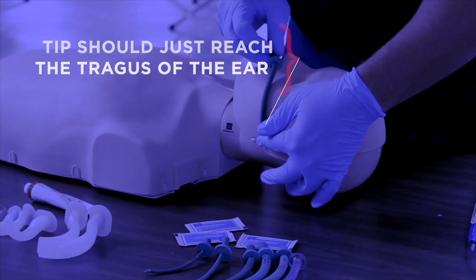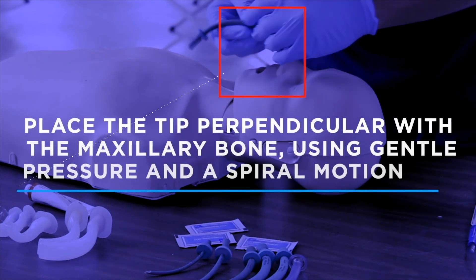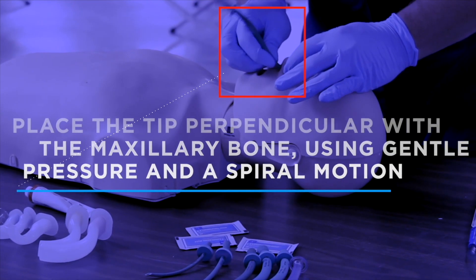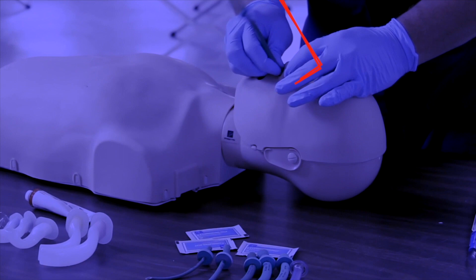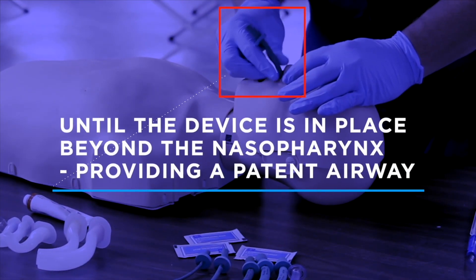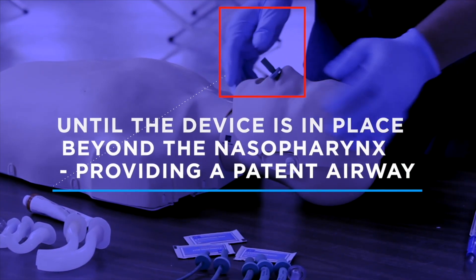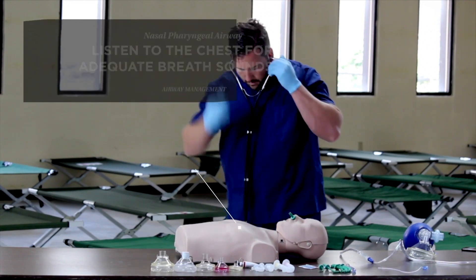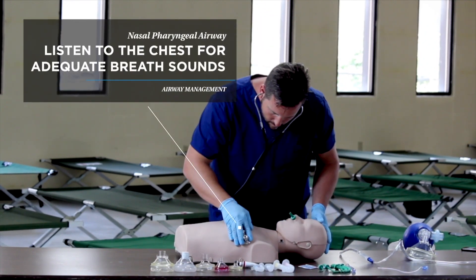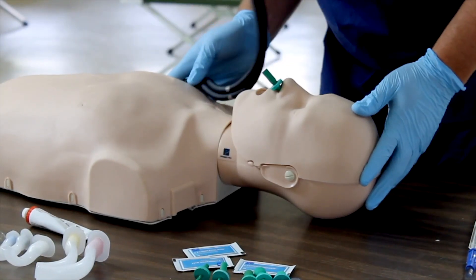Insertion of the oropharyngeal airway is achieved by pointing the tip toward the hard palate and then rotating 180 degrees until the tip touches the posterior pharyngeal wall. To insert the nasopharyngeal airway, place the tip perpendicular to the maxillary bone using gentle pressure in a spiral motion until the device is in place beyond the nasal pharynx, providing a patent airway. After placement, listen to the chest to ensure that the patient is receiving adequate breath sounds.